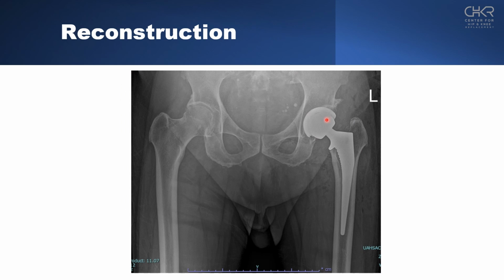And when the reconstruction is complete, the postoperative films tell the story. We can see the acetabulum now has a restored concavity, and the hip center of rotation is back where it belongs. The femur has been reconstructed with a press-fit collared stem with a dual taper design that provides stability. Leg length, or hip length, and offset have been restored to allow the patient to regain proper biomechanics.